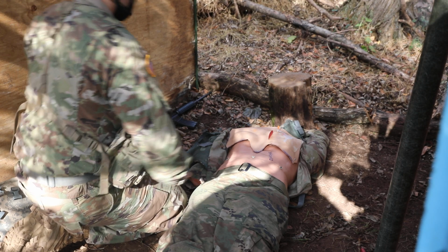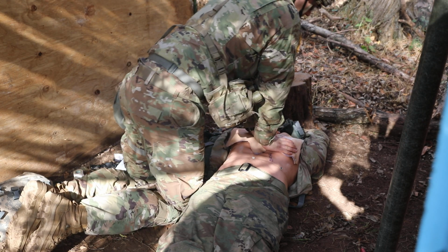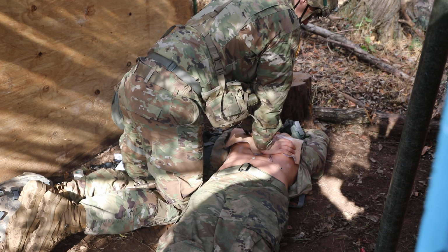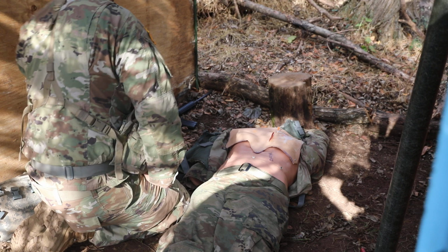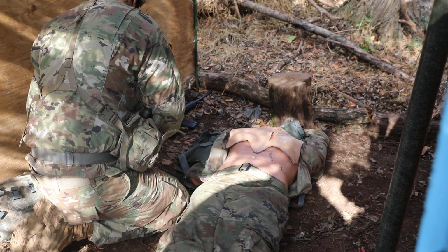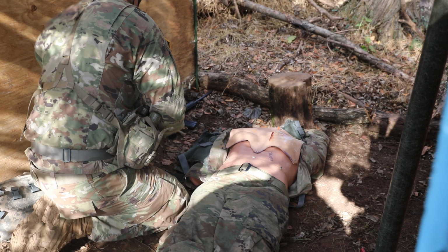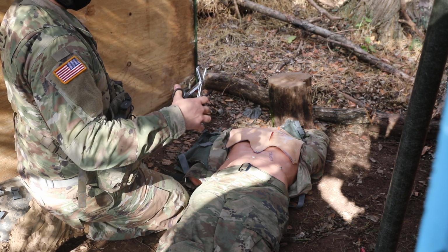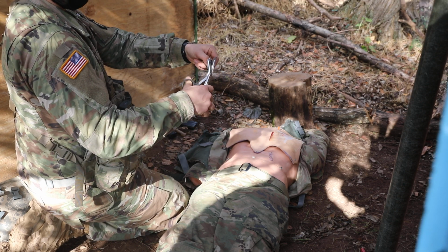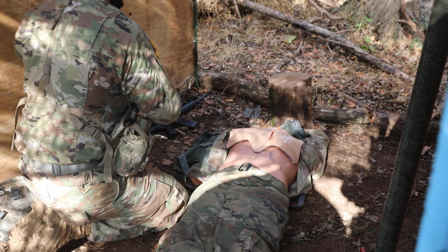Decompress the affected side by aspirating as much air as is necessary to relieve the patient's acute symptoms. Apply a commercial one-way flutter valve according to instructions or improvise using the method below. Cut a finger casing from a sterile glove. Cut off the fingertip. Tie or tape the finger casing to the needle hub.